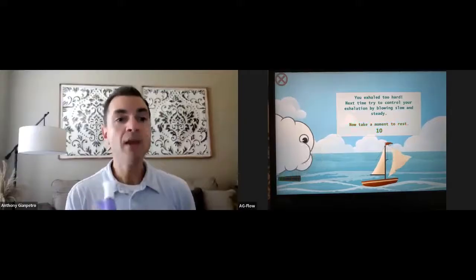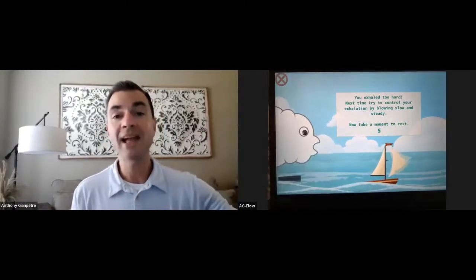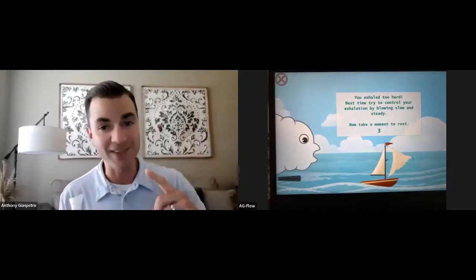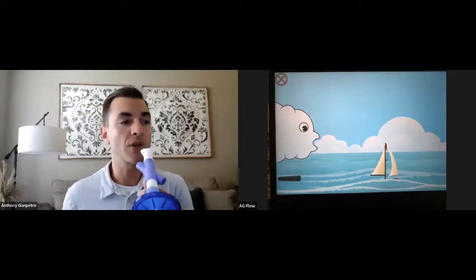The patient is typically visualizing themselves as something to the left-hand side of the screen. And notice that if I move over a little bit, there is a meter at the bottom. And watch what happens if I just blast air out any old way. It stopped me. It's saying, hey, you exhaled way too hard. You broke the sail. That's the first way that you can be unsuccessful with this activity. The goal isn't to blast that air out. We want it to come out in a steady and controlled way. So you'll notice if I do this right, that gauge is going to be hitting about halfway to push the boat across the water. So let me show you what that looks like.